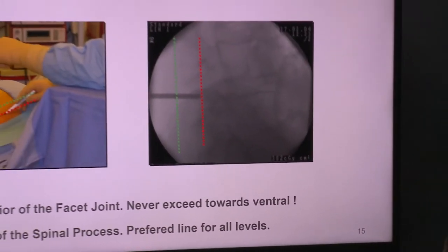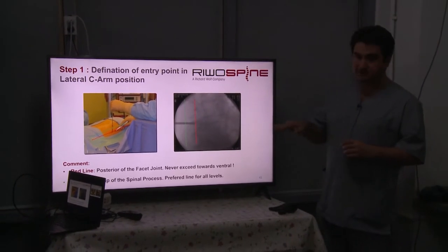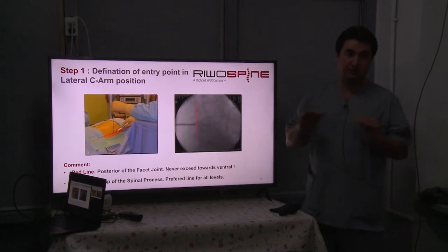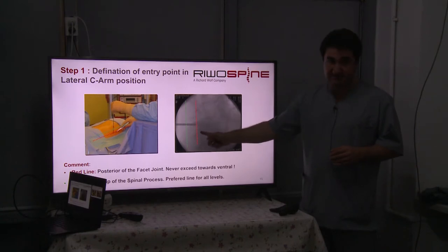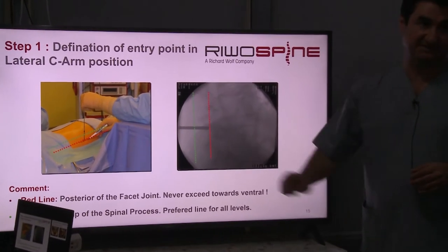Okay, let's look at the steps. First, for the lateral transforaminal approach, we define two lines here, a red line and a green line. The red line is the posterior aspect of the facet joints, and the green line is the posterior tips of the spinous process.